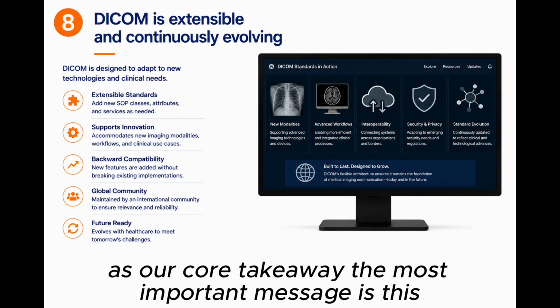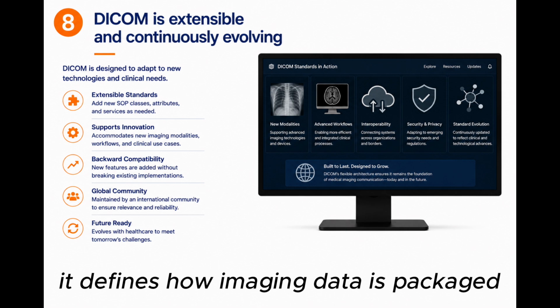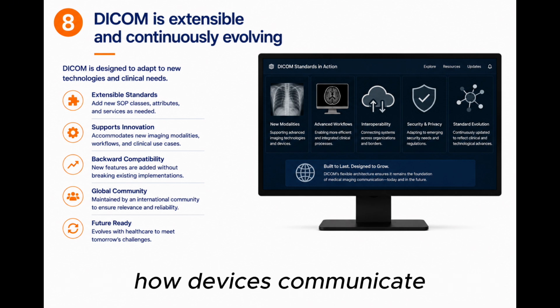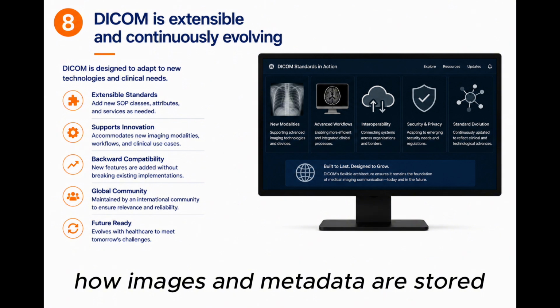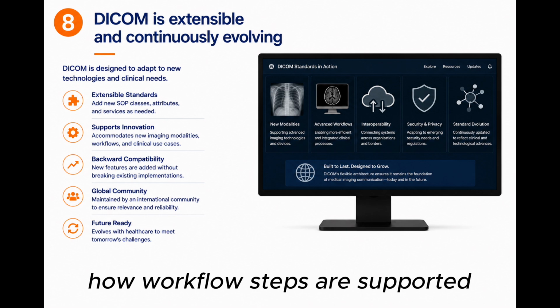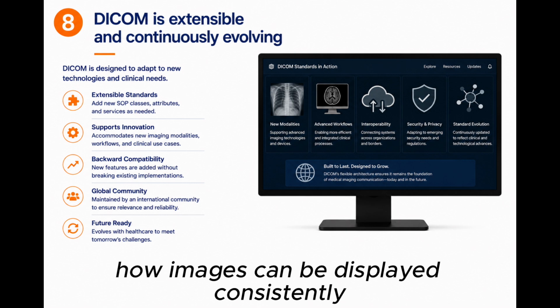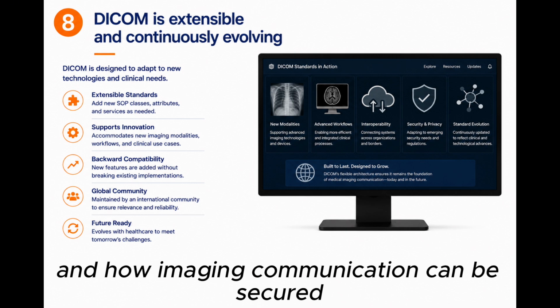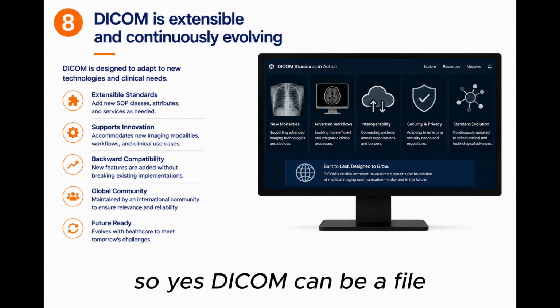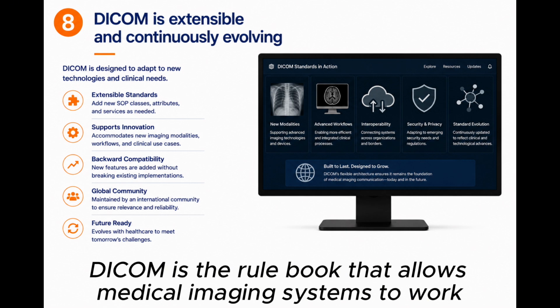As our core takeaway, the most important message is this: DICOM is the common language of medical imaging. It defines how imaging data is packaged, how devices communicate, how images and metadata are stored, how studies are queried and retrieved, how workflow steps are supported, how measurements and reports are encoded, how images can be displayed consistently, and how imaging communication can be secure. So yes, DICOM can be a file, but more importantly, DICOM is the rulebook that allows medical imaging systems to work together.